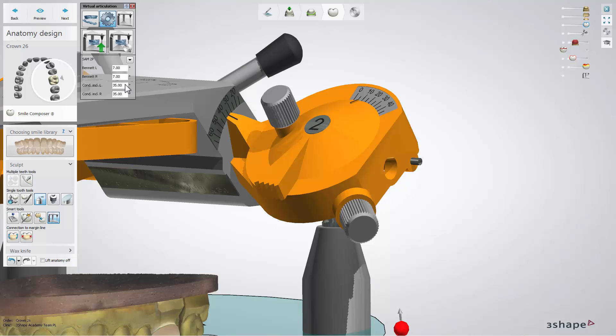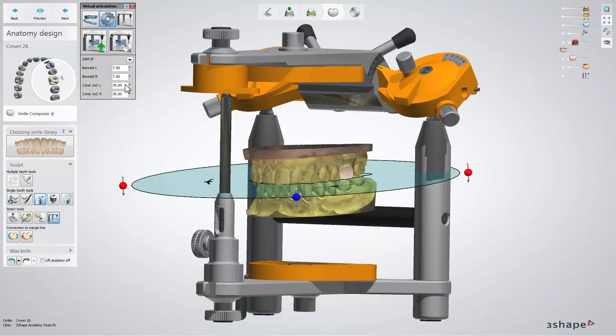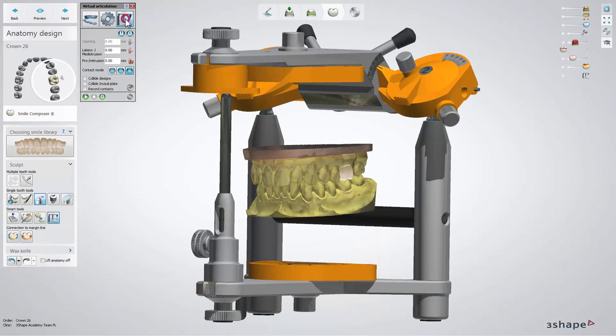To start evaluating and adapting your design, click the Articulate button. Physical articulators move the upper jaw, but in the software you have the possibility to move the lower jaw as the real jaw would move. You can configure this by clicking the L and U buttons. To reset to default static occlusion, click the Reset button.